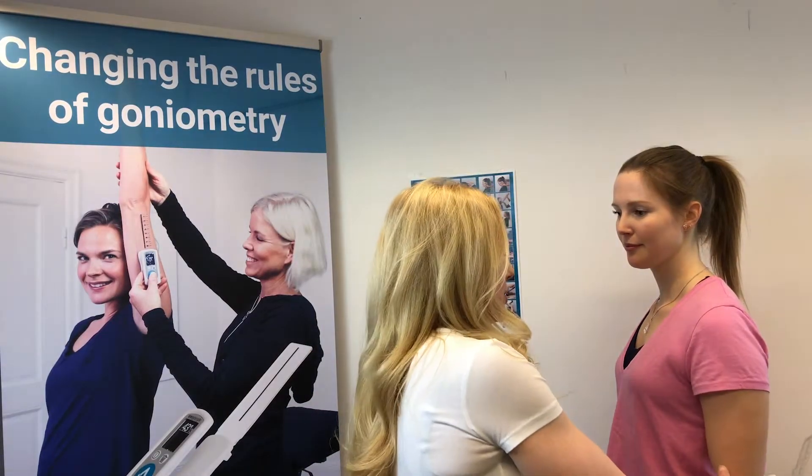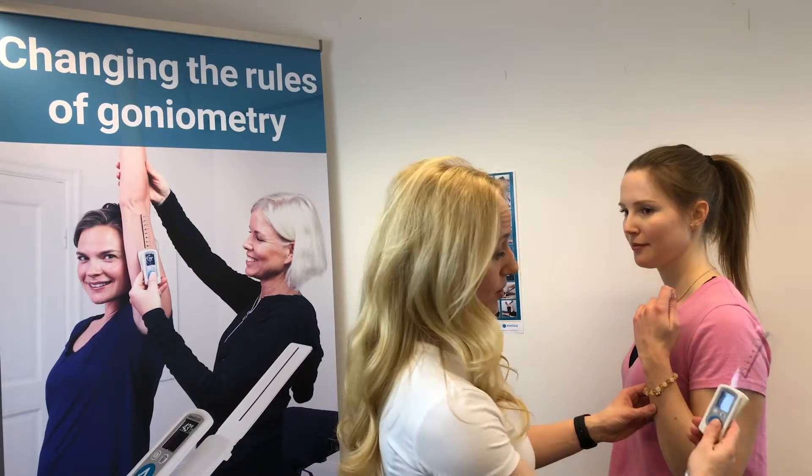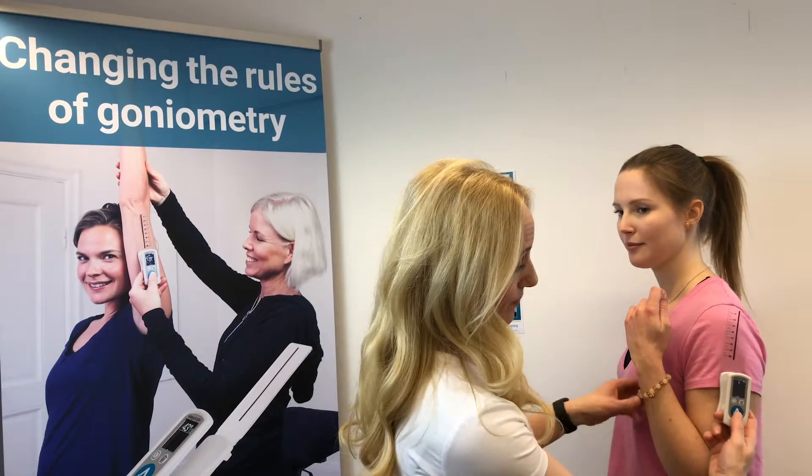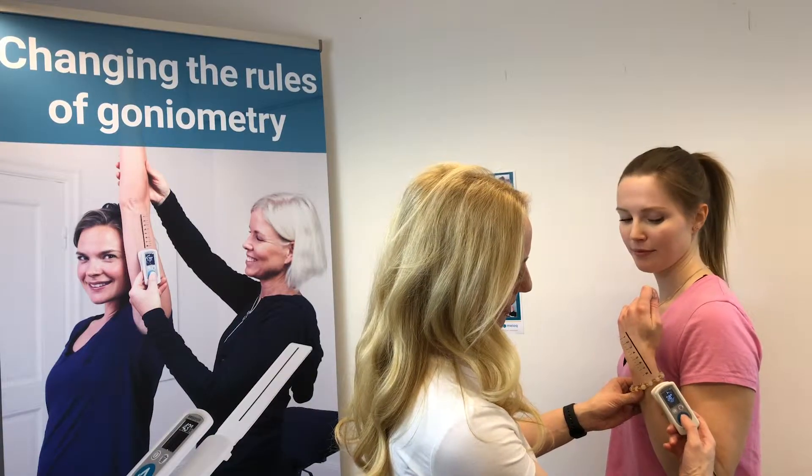We can take the patient into full flexion of their elbow. We're going to align the device with the upper part of the arm and bring it over to the lower part.